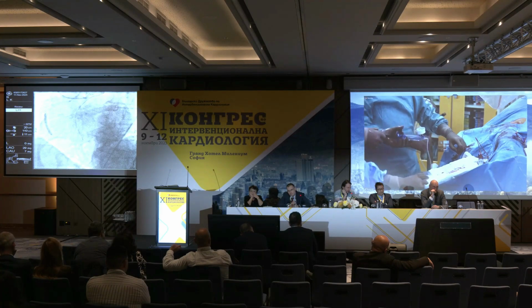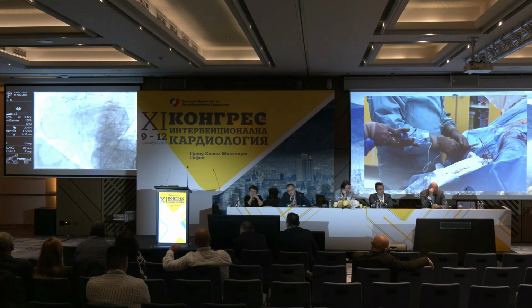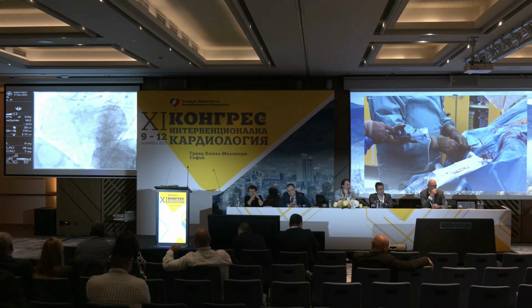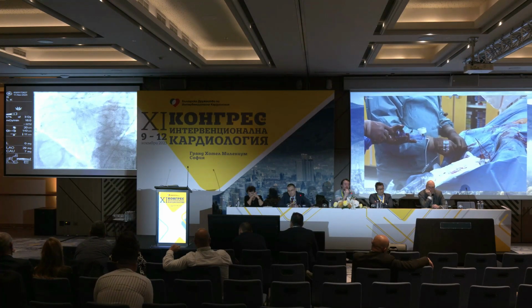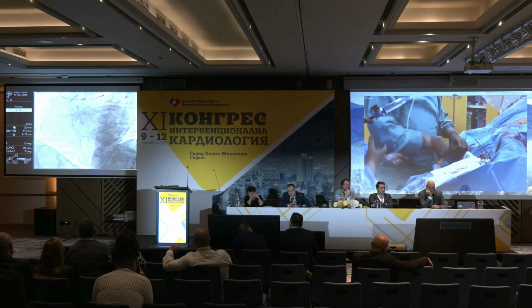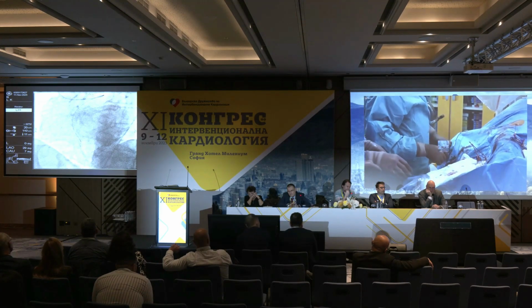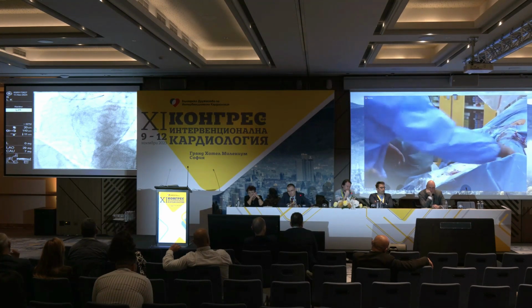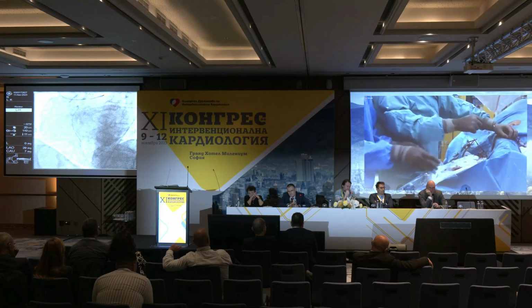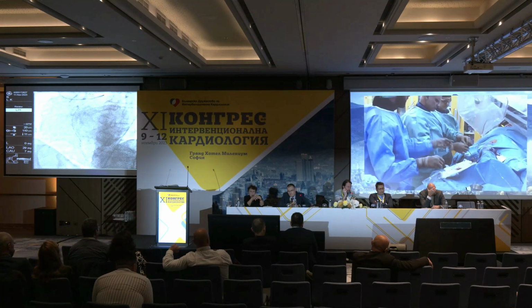Although, no. That's a good point. Let's do that. We have a wire in the other system that we don't need anymore. We need it to retrieve the microcatheter completely, but we can take the run-through from the left main and put it into this guiding. Thank you for that. Let's do that just for demonstration purposes. We are going to take another one. That's okay. I removed the wire, Dr. Gelev. So we still have time.